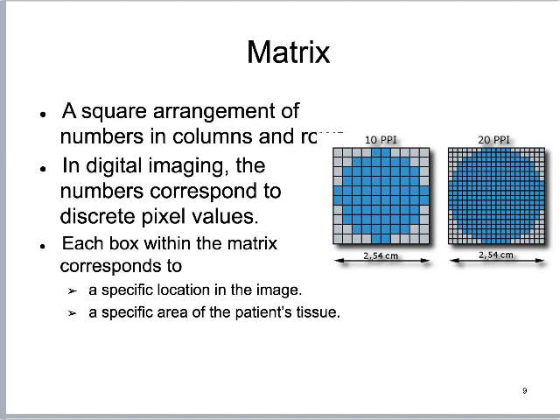But it's the best thing I've come up with, and I call it the pantyhose example. All right. Who here has seen Rocky Horror Picture Show? Right? Good. So pantyhose has a fixed weave size. When I produce a pair of pantyhose in the pantyhose factory, I'm producing it with a fixed size to this netting of the pantyhose, right?